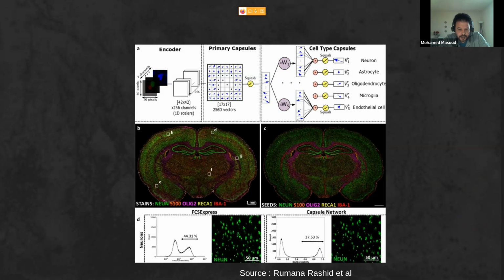Yeah, so the main reason they don't go to any other classification model is that the capsule network has a feature that makes it reliable to the orientation of the inputs. And it also has the ability to handle an open set.